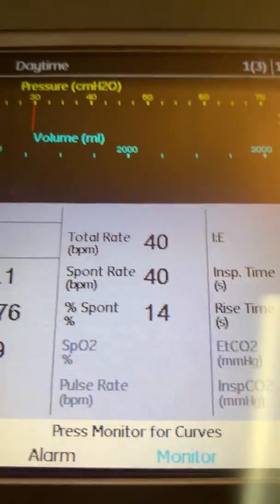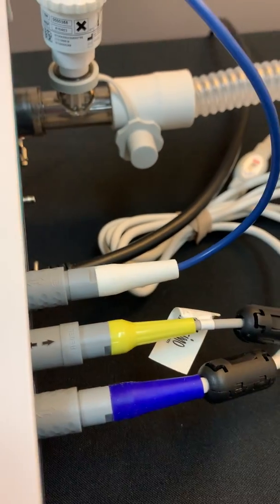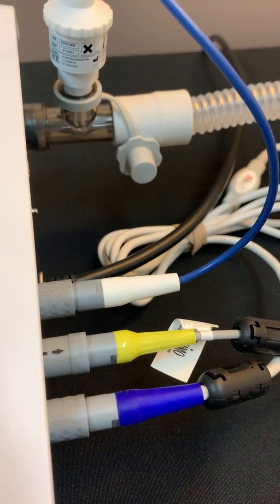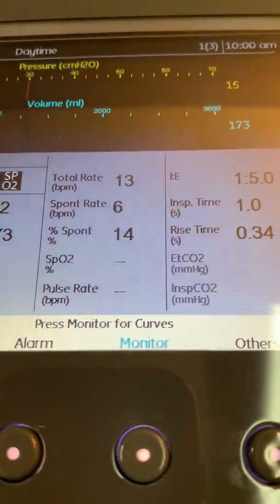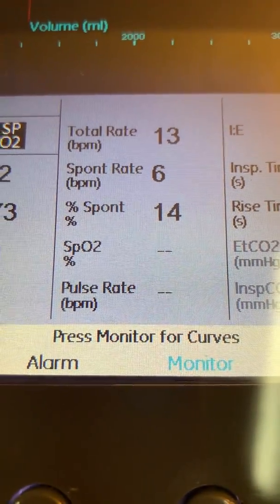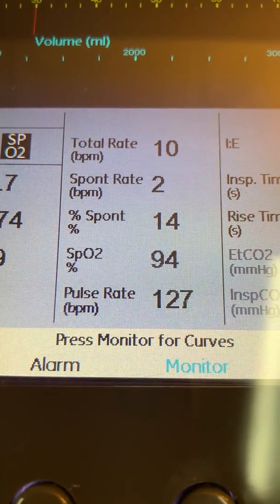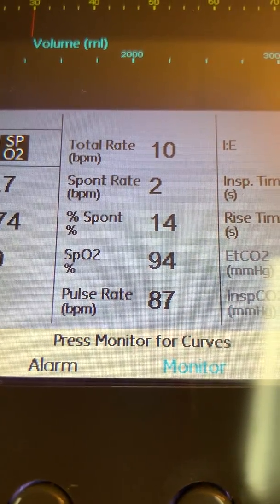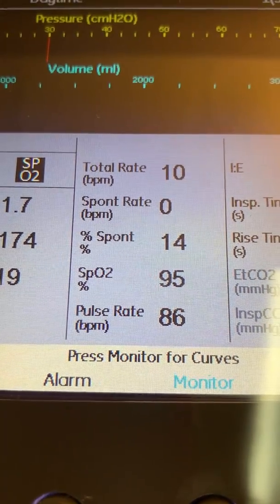The SpO2 and pulse rate are not currently connected. Pushing in the connector and placing a finger into the oximetry probe will result in an SpO2 and pulse rate being displayed on the screen shortly.